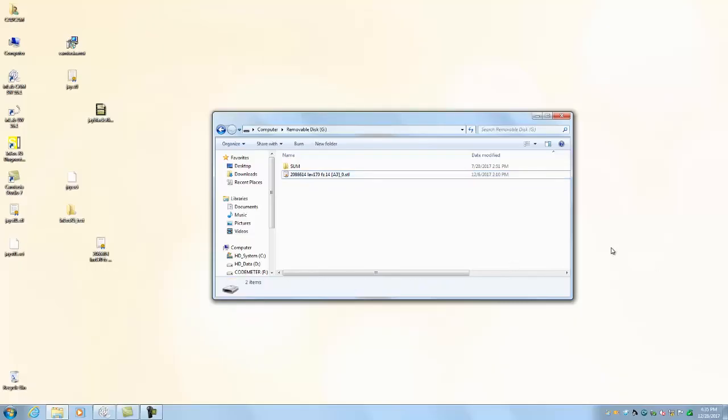Hi, my name is Matt and I'm going to show you how to load up a 3-shape STL file into your in-lab CAM software.